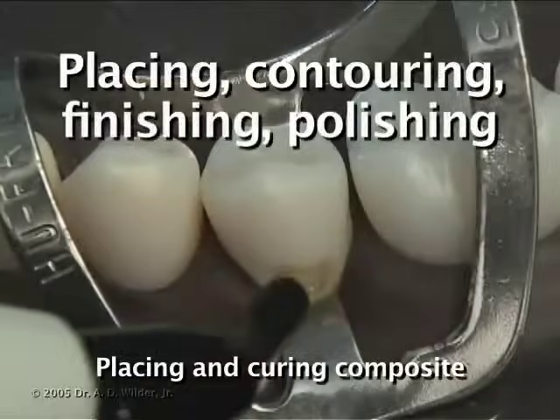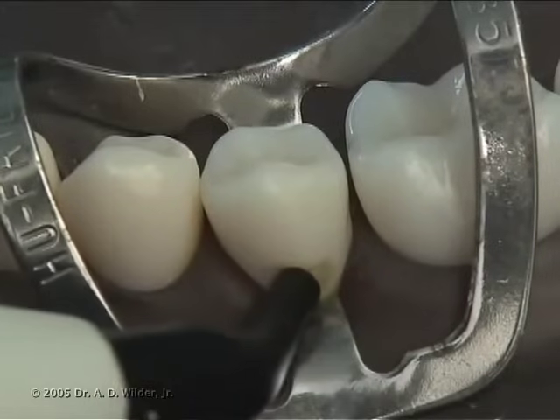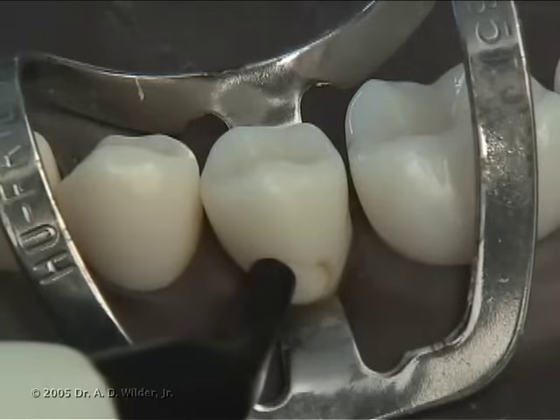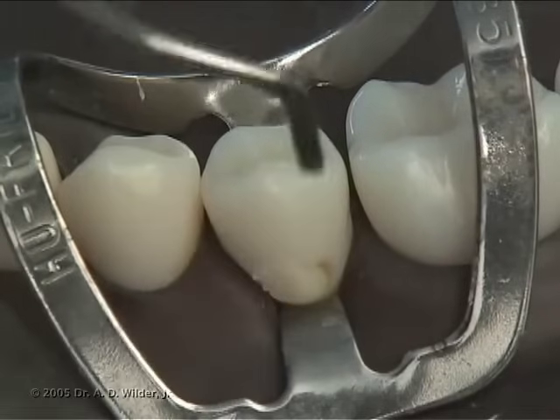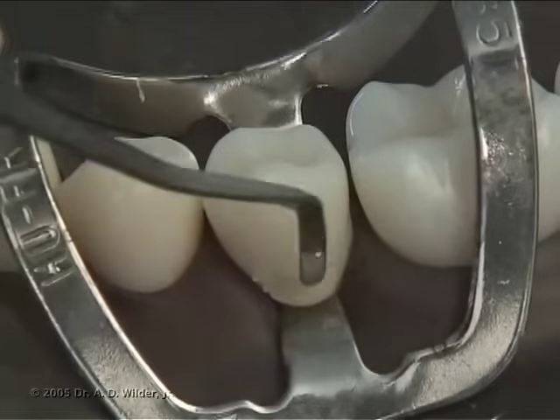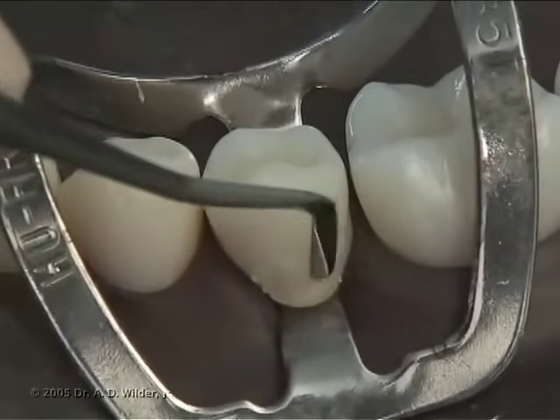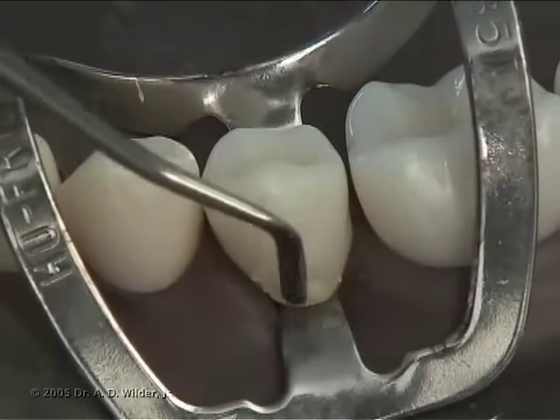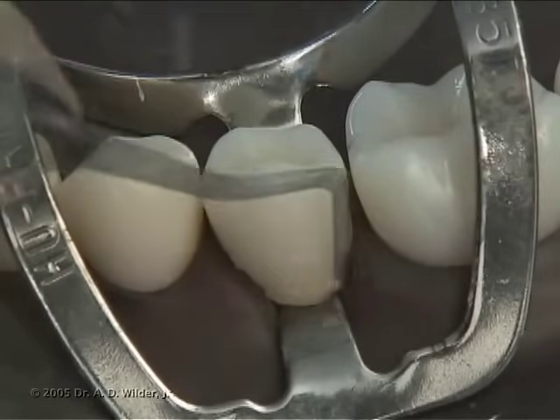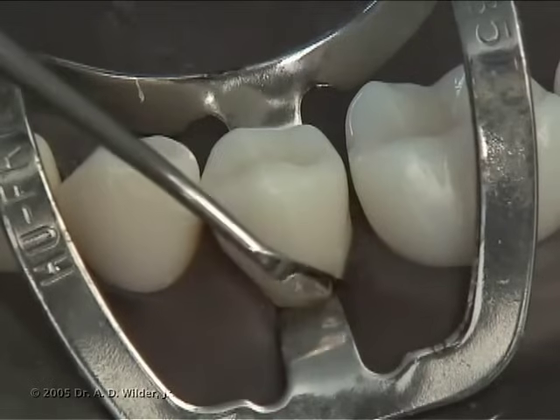Place your first increment of composite material directly into the preparation, being sure to fill in the retention features first. With a flat composite instrument, compact the composite into the preparation while also beginning to shape it to match the convexity of the tooth, leaving part of the instrument on the composite and part on the natural tooth structure.